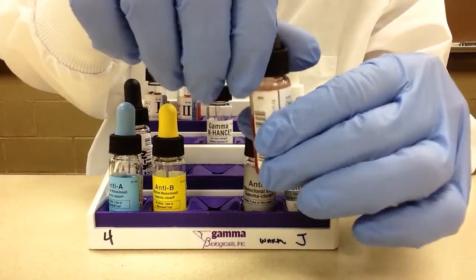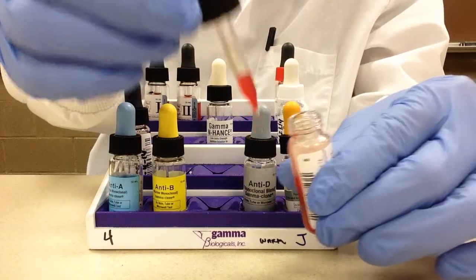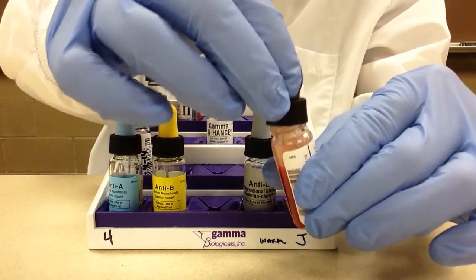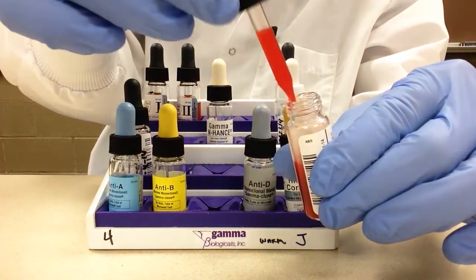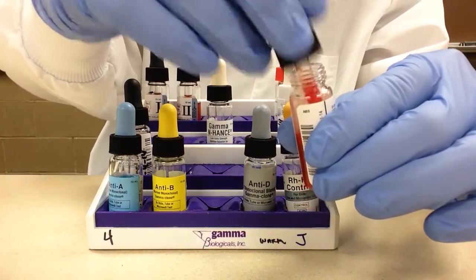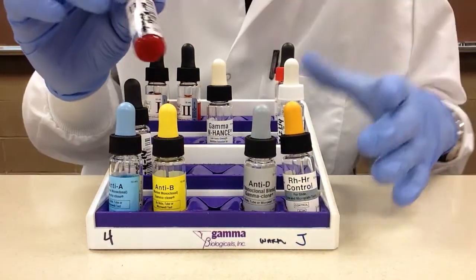Before you actually do your pipetting, it's very important that you not only mix the bottle but mix the dropper as well. I always go up and down a couple of times with the dropper before pipetting cells or any reagent into the tube.